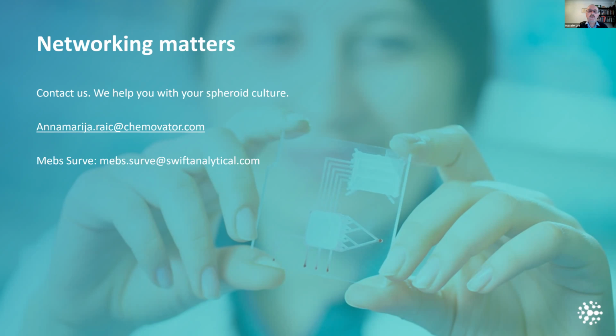Since the product is cell repellent and at the same time can interact with material to produce better networks, what are the biomaterials that can actually interact with BioFloat Flex? The matrix does not interact with the BioFloat Flex. The BioFloat Flex is used to treat the surface of the 96 well plate, and the matrix is added, and the proteins in the matrix interact with the cells and not with BioFloat.